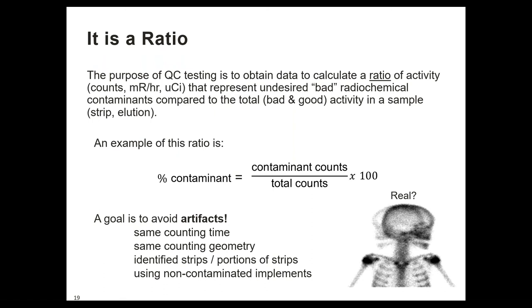Look at that pediatric bone scan on the right corner. Is that real? Is this really a two-headed child? I don't think so. That's an artifact. We know that child moved their head during image acquisition. That's an artifact. Well, we're trying to identify and exclude artifacts in QC testing.